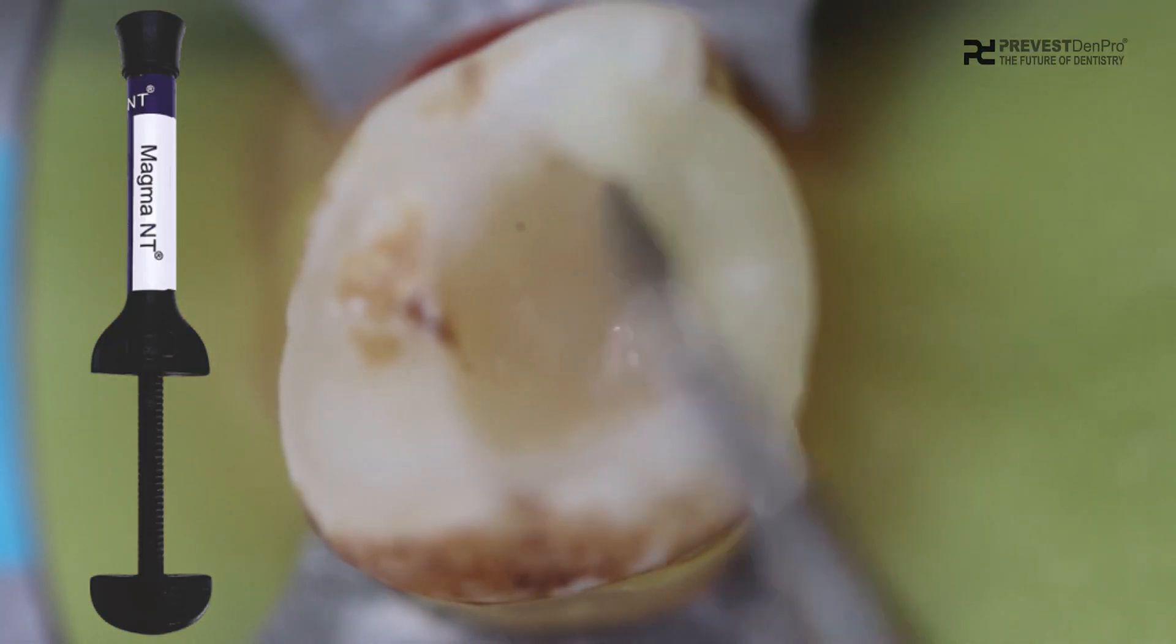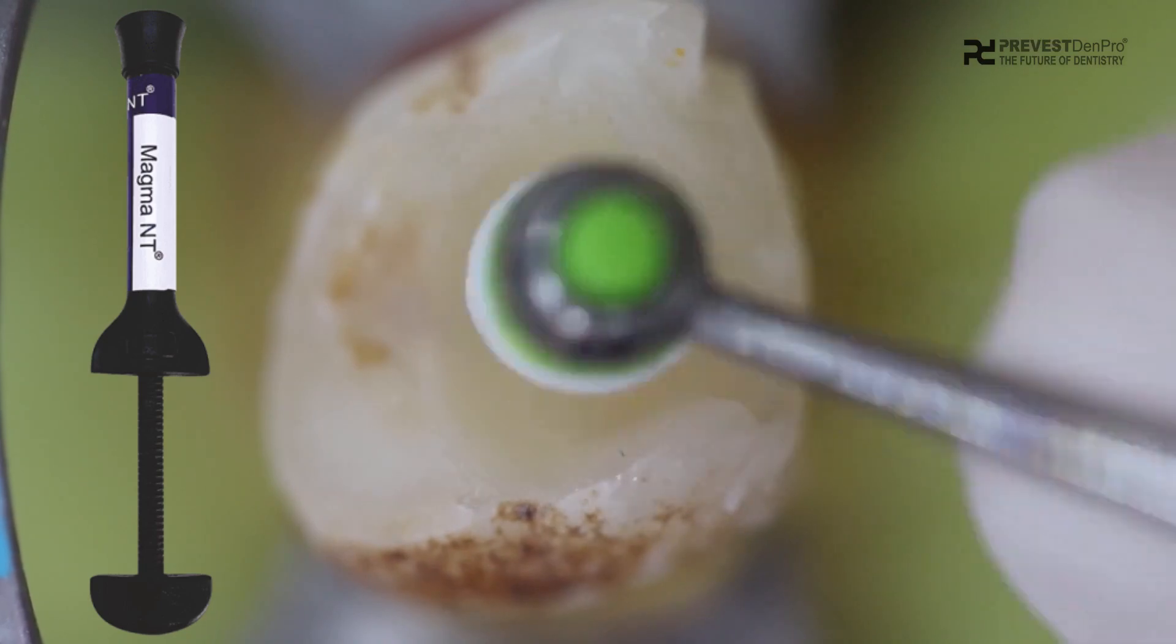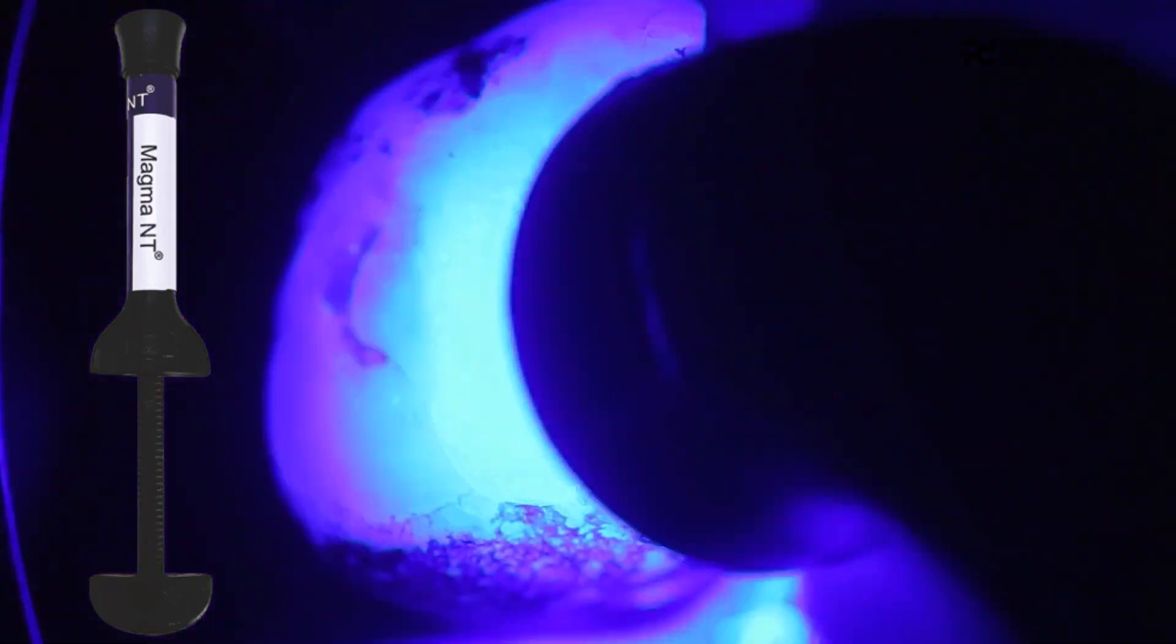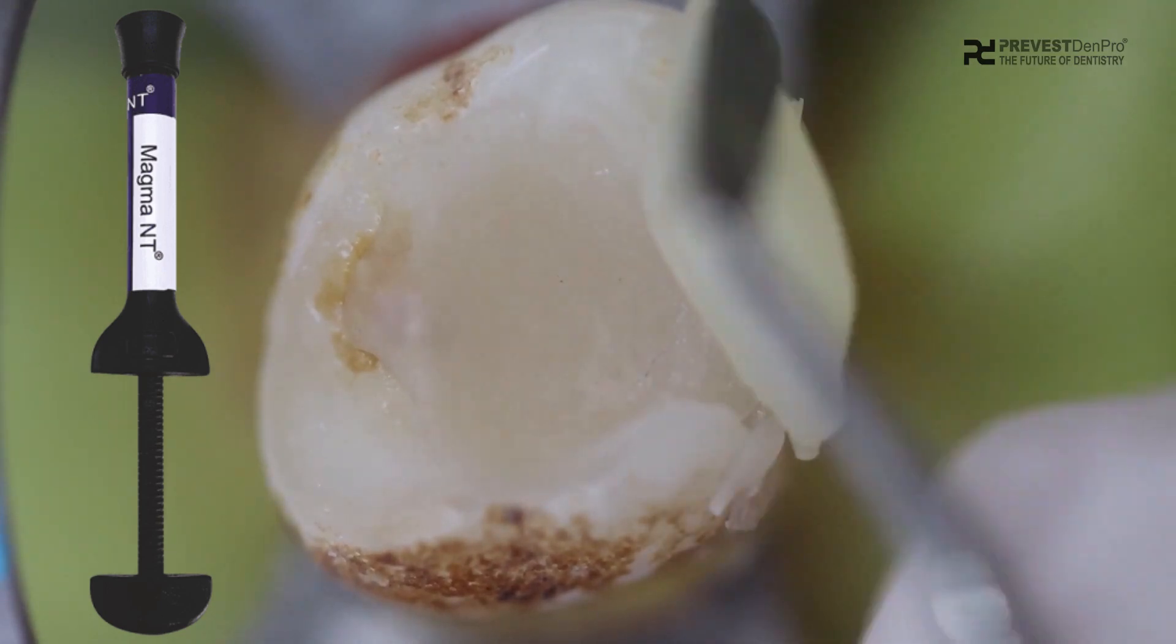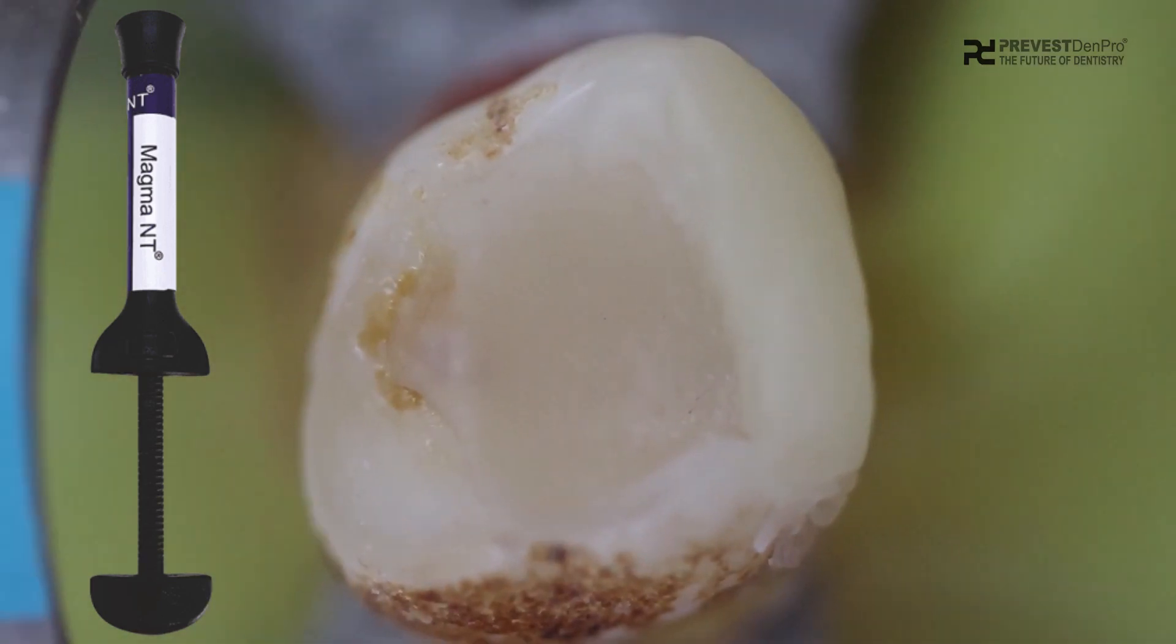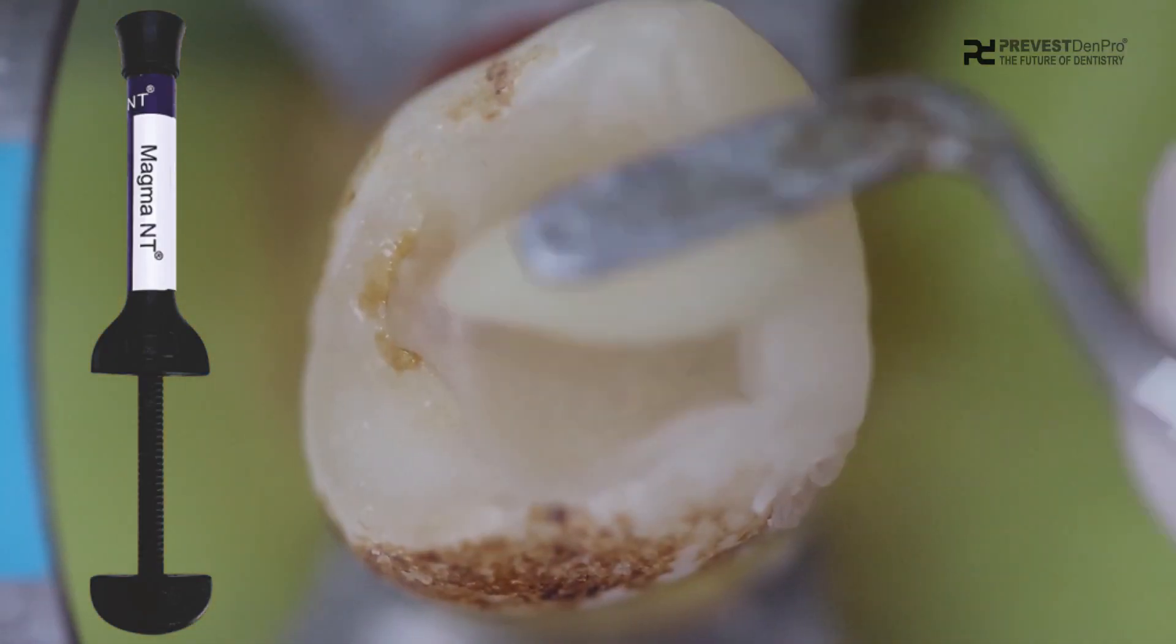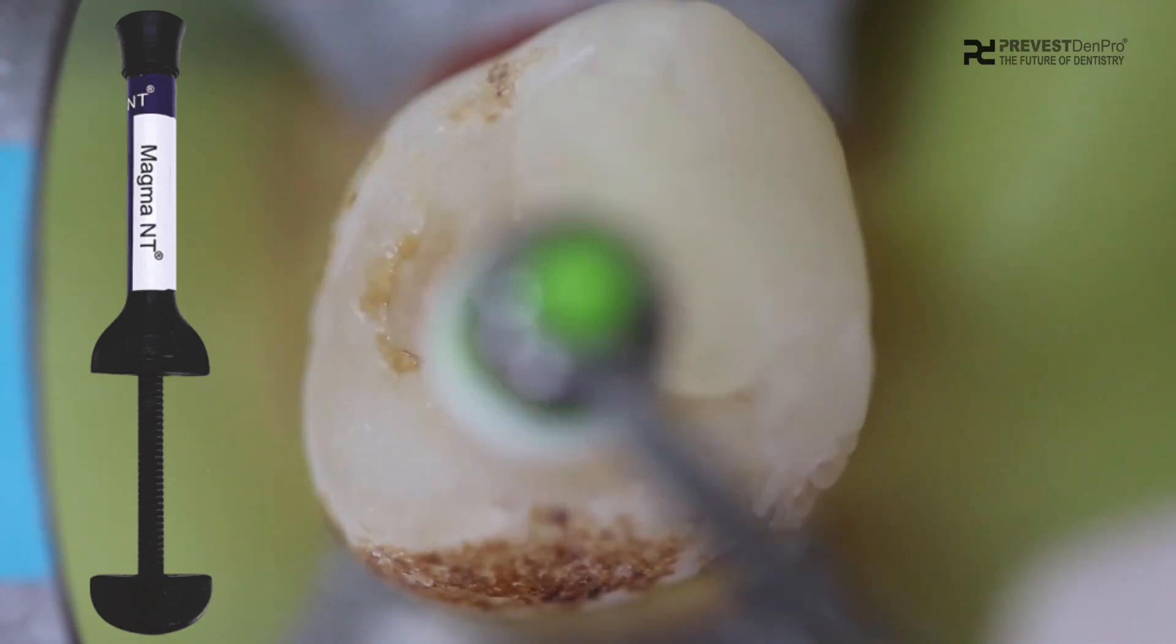Add the material in increments of maximum 2 millimeters and then contour it.